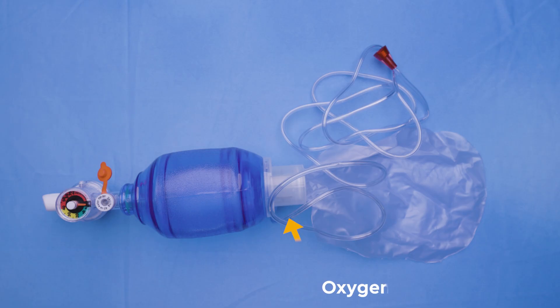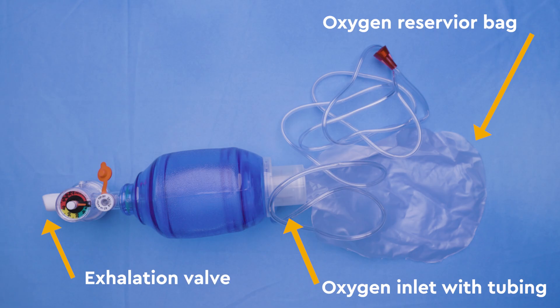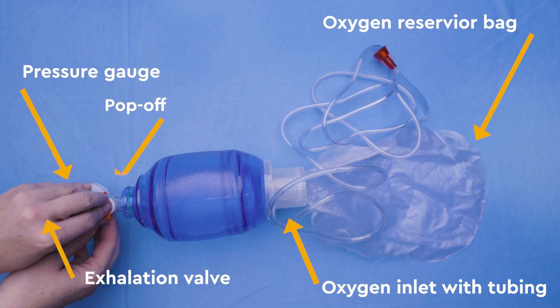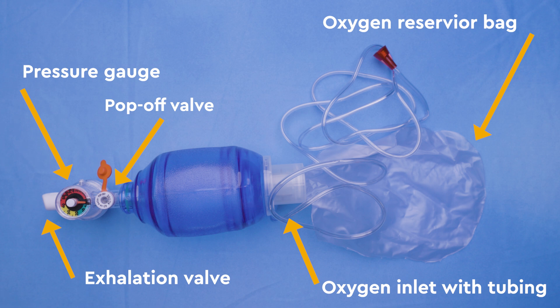It has an oxygen inlet with tubing, an oxygen reservoir bag, and an exhalation valve. Your bag may also have a pressure gauge and a pop-off valve. The pop-off valve should always be left open. It is dangerous to give breaths with the pop-off valve closed.